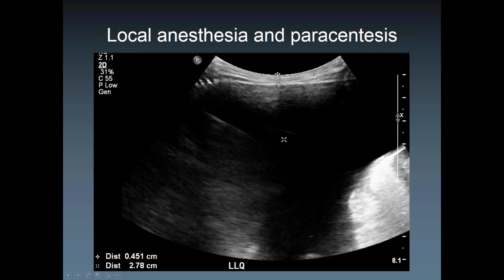So you want to go in a very tangential pathway, because if you go in straight, you also increase the risk for a leak. A leak means that if your patient has still residual ascites after the procedure, because you may not always be able to drain the complete fluid for different reasons, and you have still intra-abdominal pressure that kind of pushes the fluid out, a paracentesis-related ascites leak is a nasty thing to have.